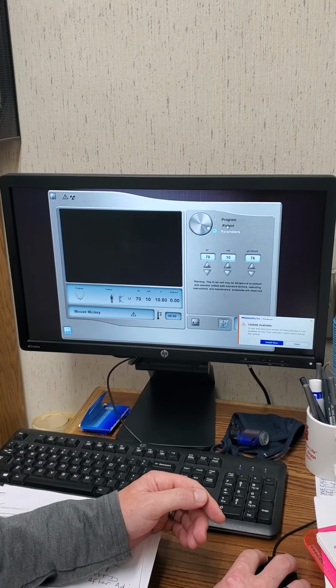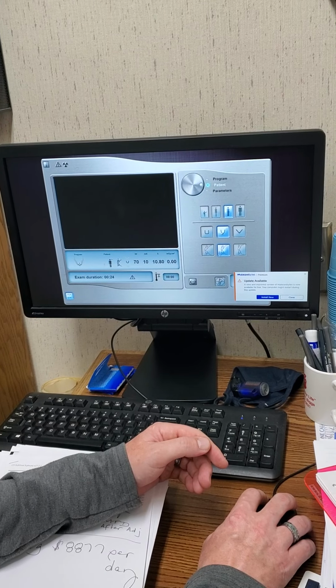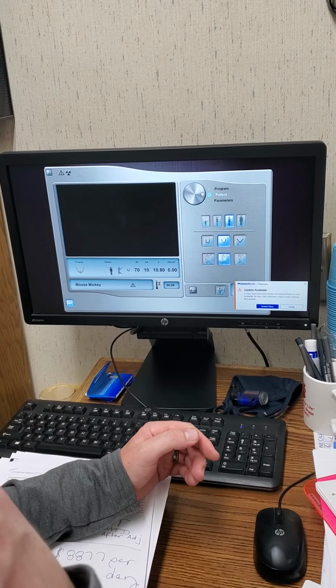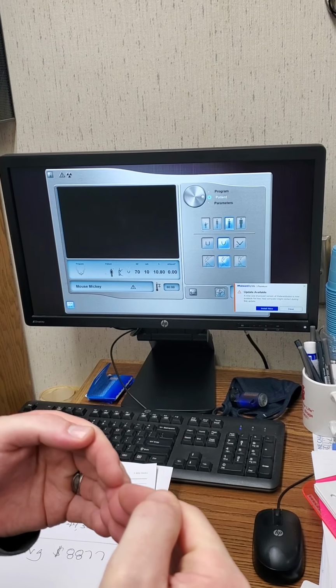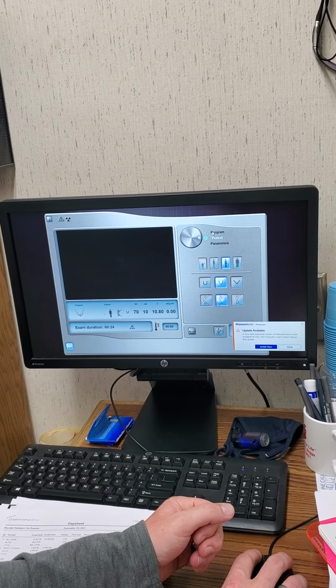That second picture is the vault, I believe. Is it how, do you have a U-shaped vault, a V-shaped vault, for the palate? Yeah. Okay. This is actually for the shape of their jaw. If they have more of a triangular jaw, or standard rounded jaw, or if it's a real square jaw. I thought it was the vault, sorry.